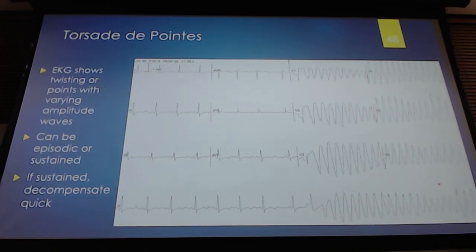If we look at this ECG here, okay, you have a person that came in, and they're like, man, I was not really feeling all that well. I was having some palpitations. I felt like my heart rate was off. And we did our initial portion of the ECG. We've got our P, QRS, a T here, P, QRS, T. So that looks okay.